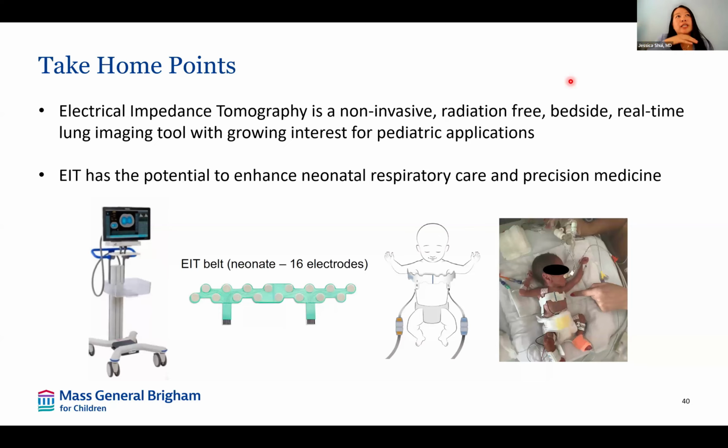You want to make sure that all the areas are recruited before you walk it down, because the areas of measured relative atelectasis compared to overcompliance are going to be based on that first value. Specifically for this cohort, though, we saw on X-ray that these patients were already very overdistended. So we adapted our protocol in this case to not increase the PEEP even further, risking air leak in those poorly compliant lungs.